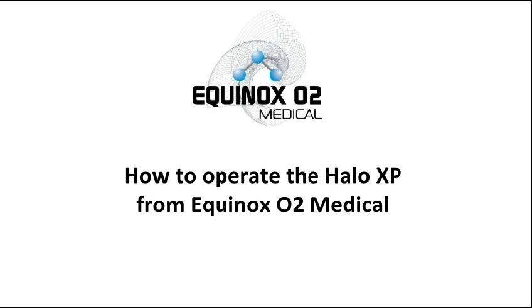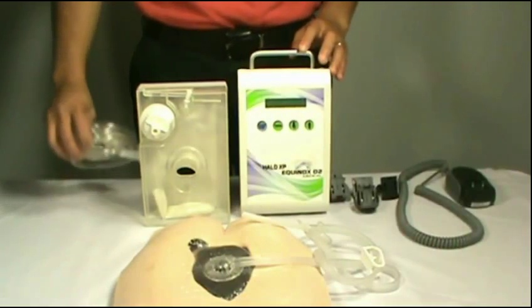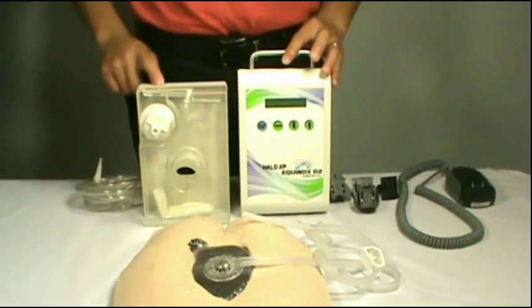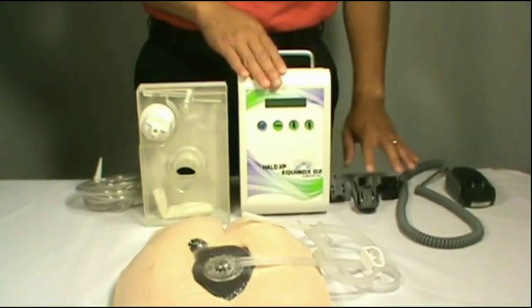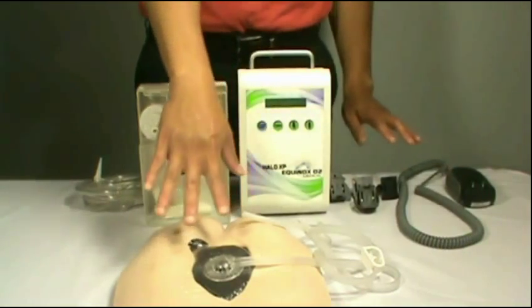How to operate the Halo XP from Equinox O2 Medical. First you will need your canister tubing, your canister, your Halo XP pump, outlet adapter, your power adapter and of course your wound.